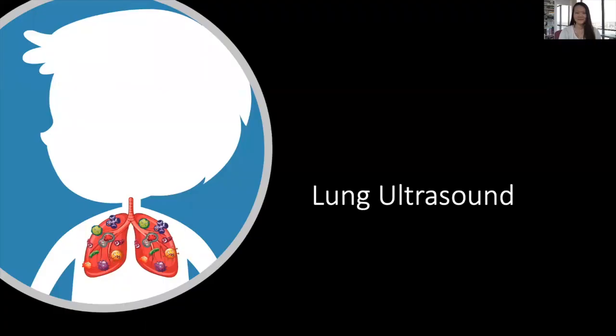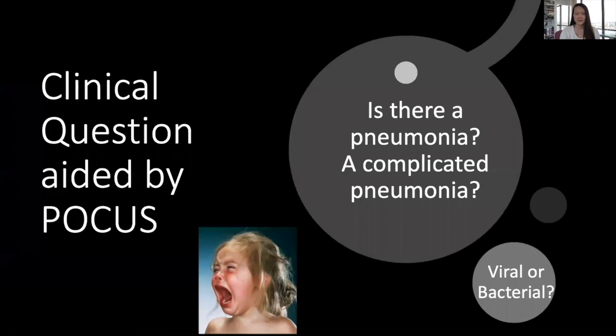Thank you. So the next topic is lung POCUS, which I'm very excited to discuss with you, since it's arguably one of the most useful applications in our day-to-day practice in the pediatric emergency department. So the most common scenario where this is helpful is when you're seeing, let's say, a healthy toddler who's coming in with coughing and rhinorrhea for a few days, febrile for 3 to 4 days. And when you're trying to auscultate her lungs, she's screaming her head off. And your question at the bedside is really, is this just a viral illness or is there a true pneumonia?